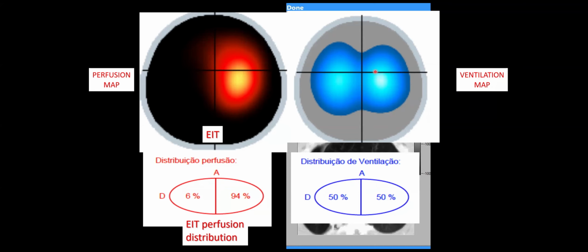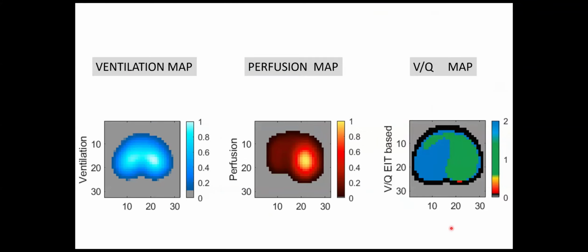And nowadays, we are trying to superpose these two images to provide a map for the physician, like in this case, represented here. We have the ventilation map, the perfusion map, and then we put one on top of the other. And for clinical purposes, we just represented 3 colors because there are 3 basic clinical conditions for the lung physiology.